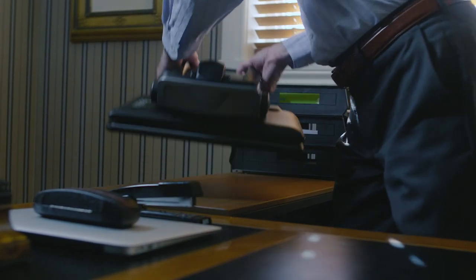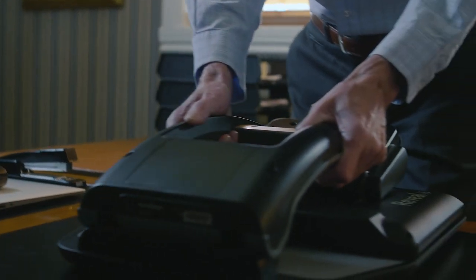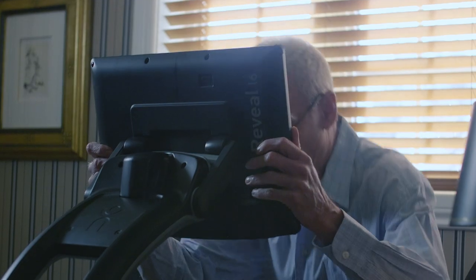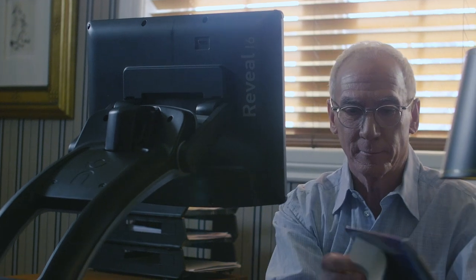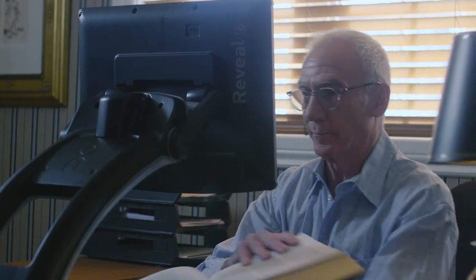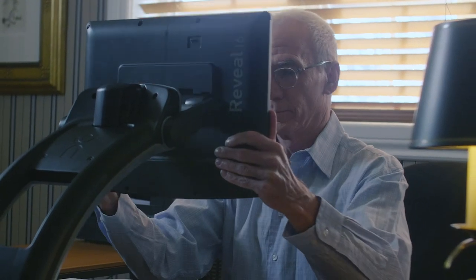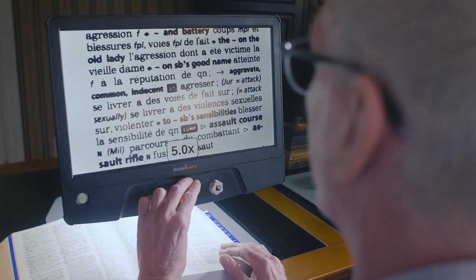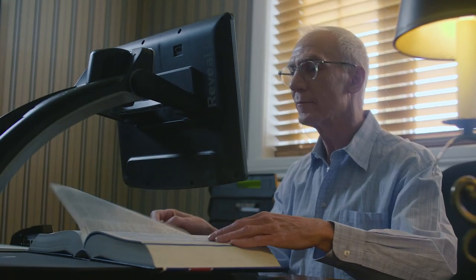Forget your old basic CCTV. HumanWare introduces the Reveal 16, the new digital magnifier. With its latest technology and innovative features offering the best image quality, the Reveal 16 is designed for seniors looking for an intuitive and easy to use digital magnifier that will help them live their daily activities.